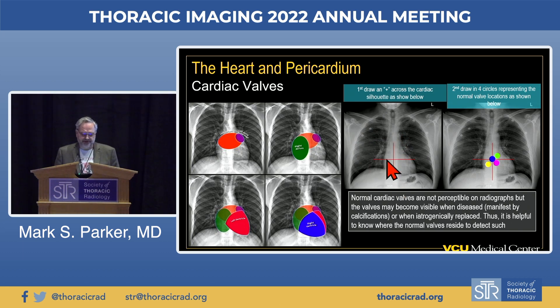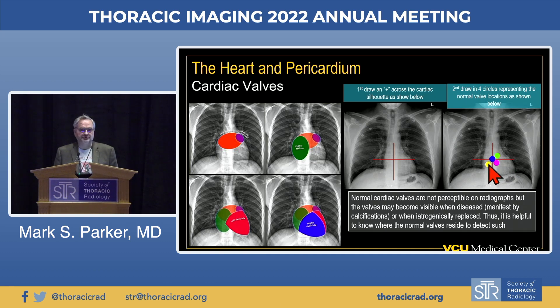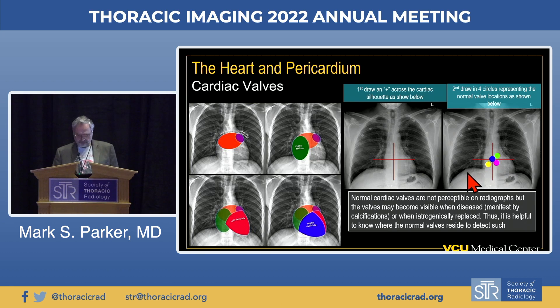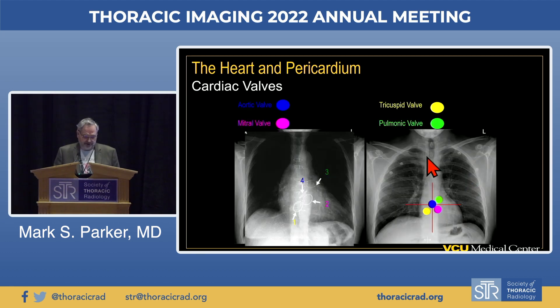Draw an X across your mediastinum and superimpose the four valves. Dead center on top of the spine is the aortic valve. Out toward the left hilum is the pulmonic valve. Overlying the left heart is the mitral valve. Overlying the right heart is the tricuspid valve. The mnemonic PAMT helps remember these, and the valves zigzag on and off the spine. In this patient, all four valves were replaced—tricuspid, mitral, aortic, and pulmonic.